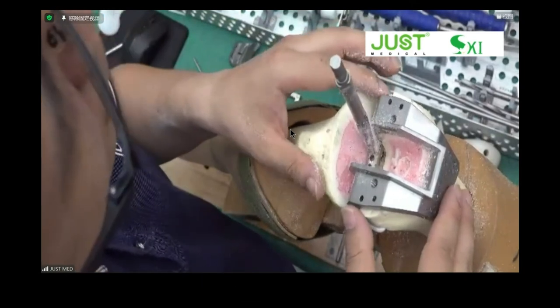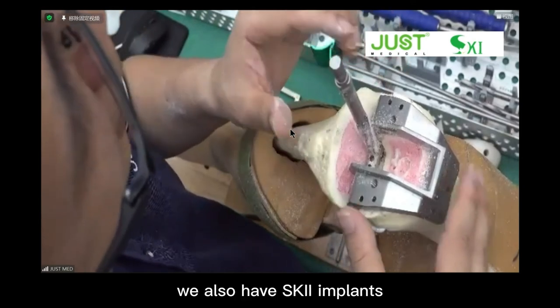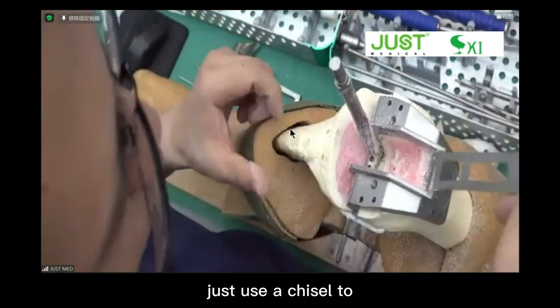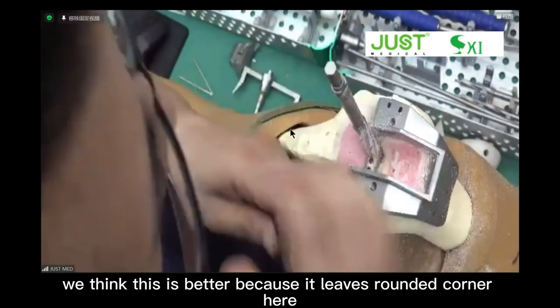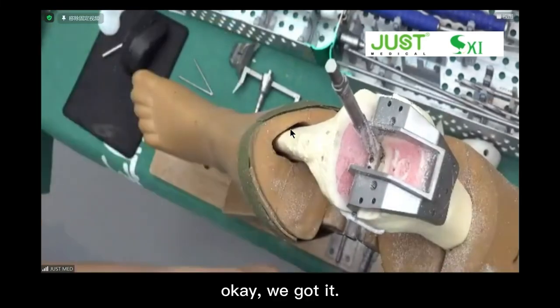Okay. Actually, this is the technique for our SK1 implant. We also have the SK2 implant. For the SK2 implant, we just use a chisel to do it like this. But we think this way is better because it leaves a round corner here. Okay. We got it.